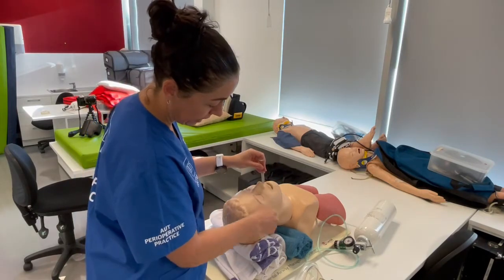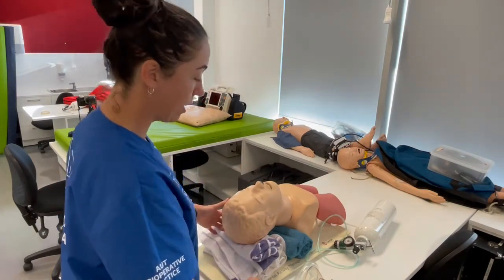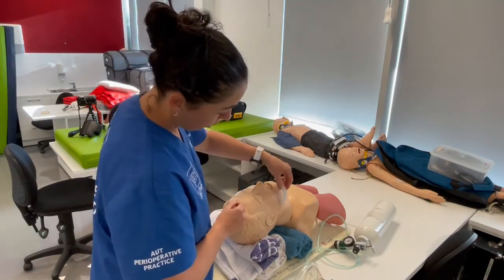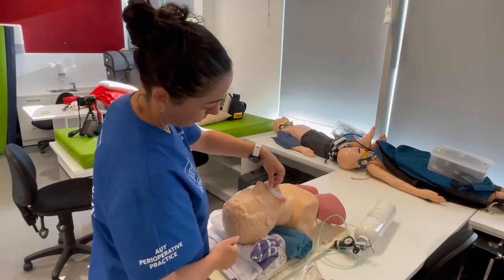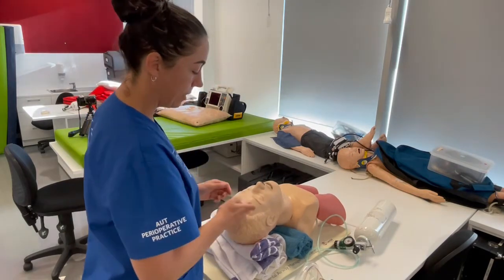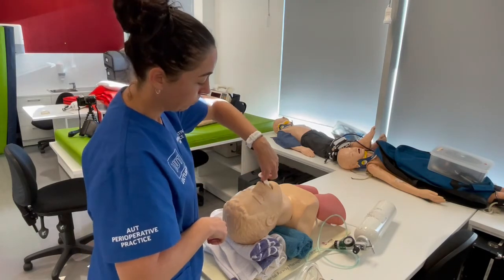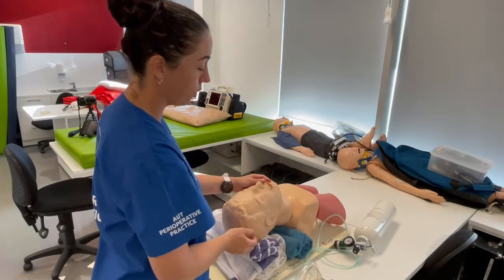The next airway adjunct is the oral airway, or Guedel. It is sized from the angle of the mandible to the maxillary incisors — you can measure it side on, back to front, or upside down, the key is that measurement. Provide a bit of head tilt, open the mouth, insert the tip facing cephalad, advance until you meet resistance, then rotate 180 degrees and slide it in. The flange should sit against the teeth but below the lips.